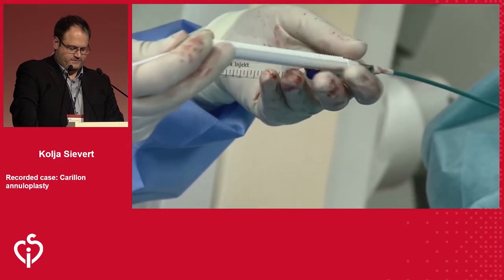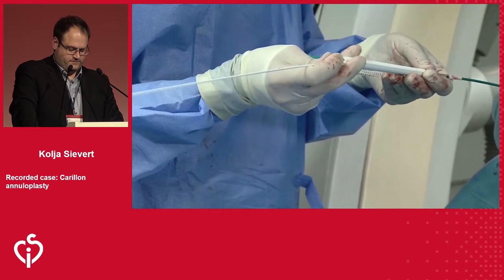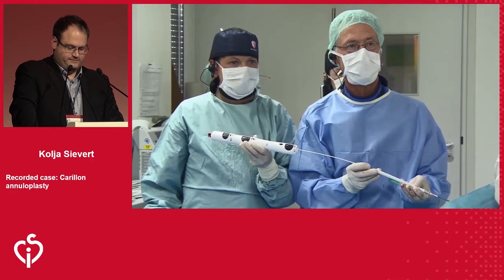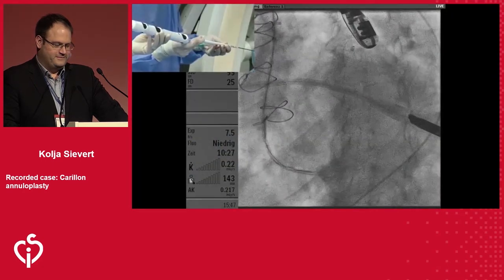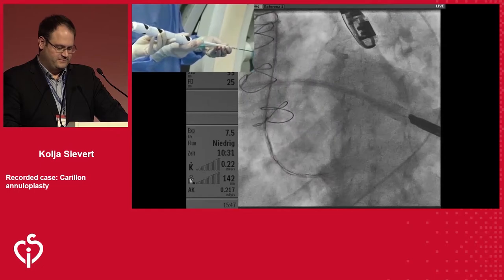So now I attach this loading tool to the catheter. Okay, so now I will advance the device under fluoro control, because sometimes the sheath is actually pulled out, sometimes it's moved in when you advance the device. Okay, now you see, Kenneth, it's going around the curve.